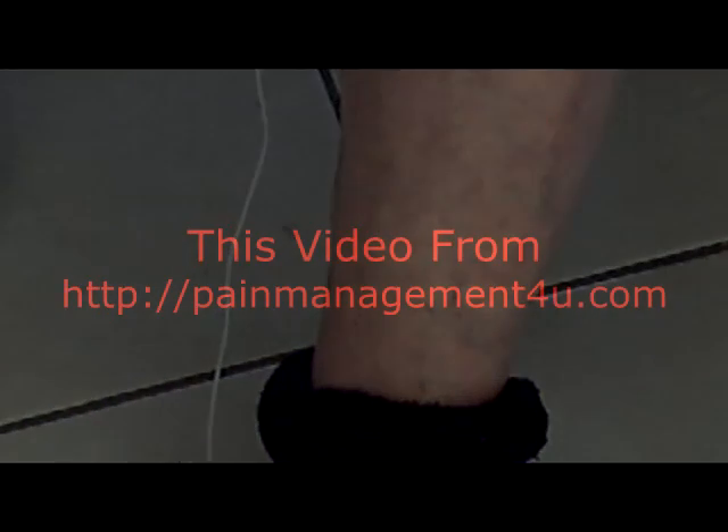Notice how the muscle in my calf is twitching in time to the pulses. This is the action that helps pump blood through the foot.